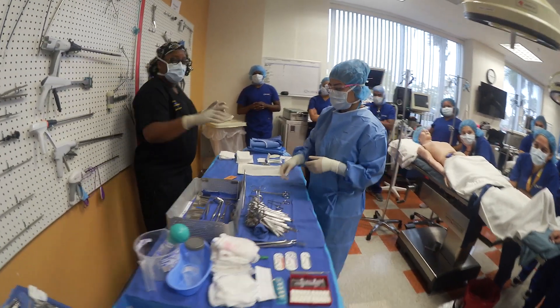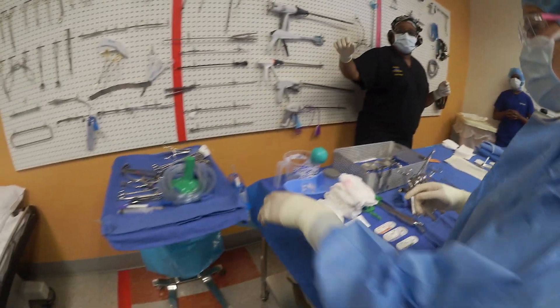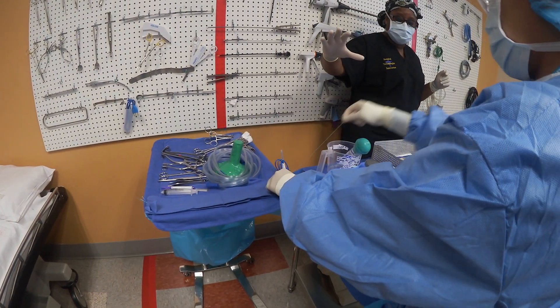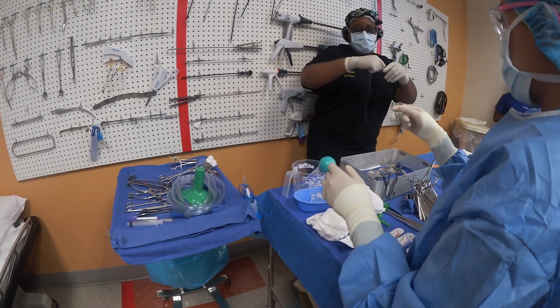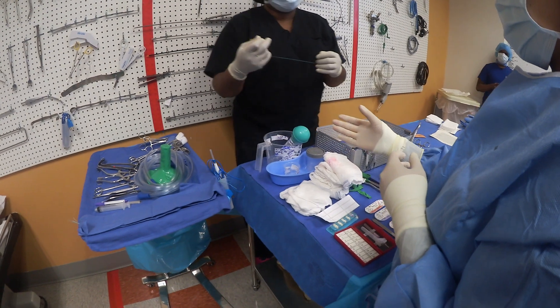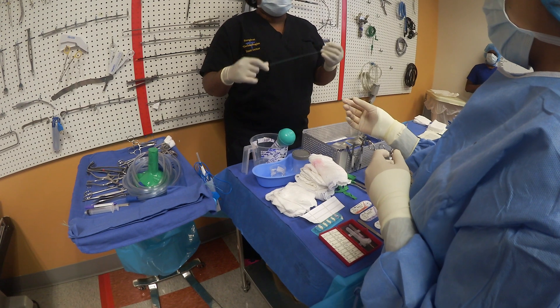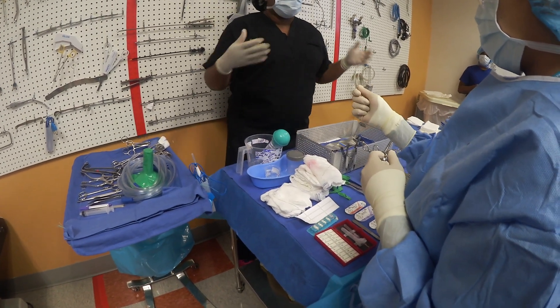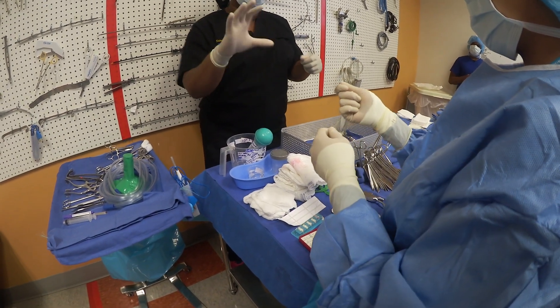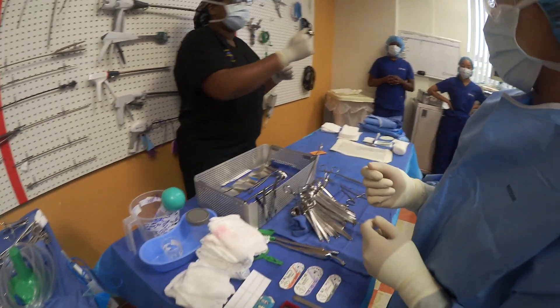Pass the free tie to the surgeon. Your free ties are — muscle memory — where did you put your free ties? Pass one. When I want my free tie, put your hand out. How would you like it? Because now I'm your tech. However you like it — if that's how you like it, I'm going to give it to you just like you like it. We adjust. But make me feel it — we want to make sure that tie is in our hand.